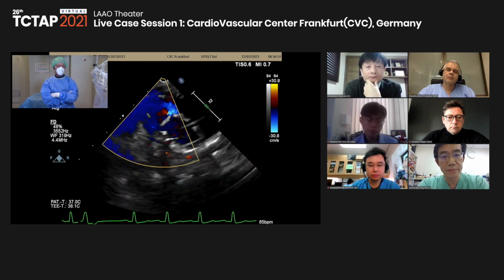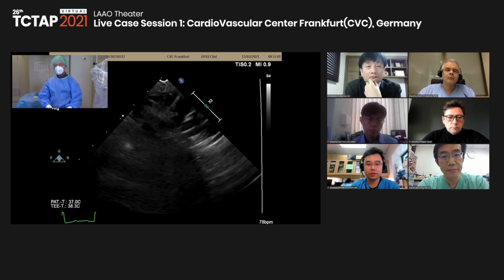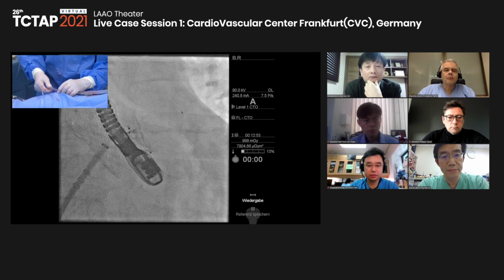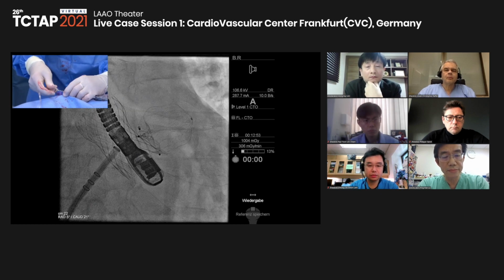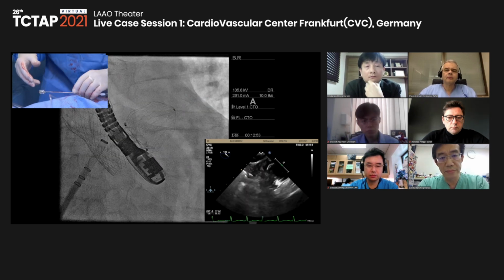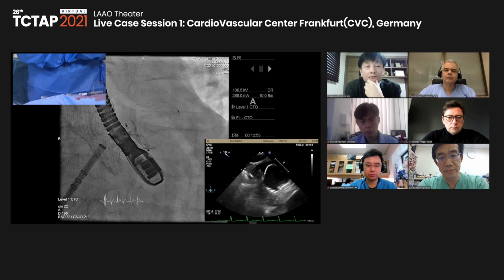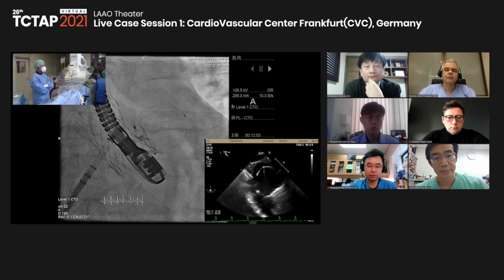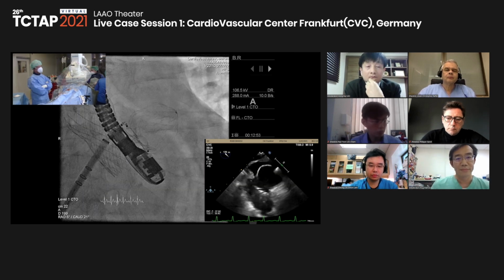Okay, good. So I think I will release it here. Okay, still in place. And no change, obviously no change regarding the leak. This would be very unlikely that this changes now.